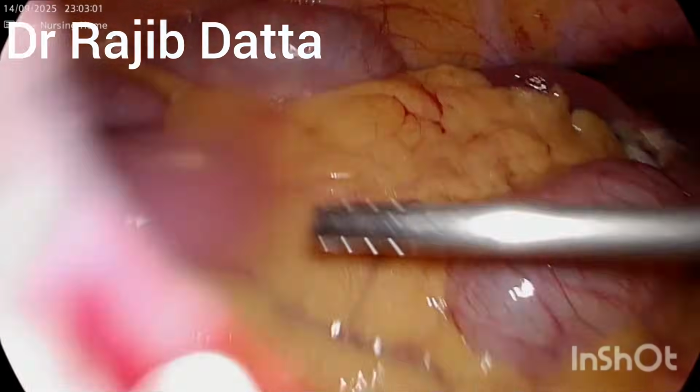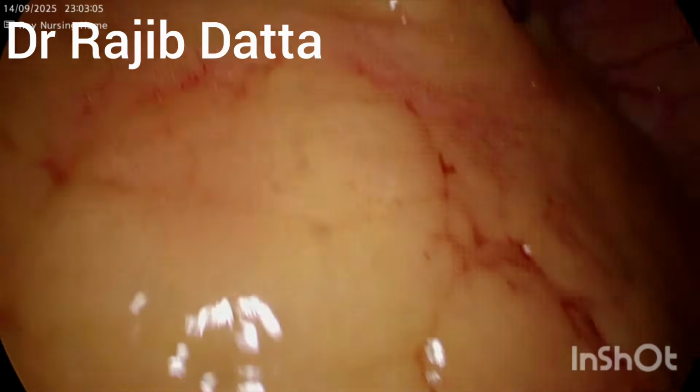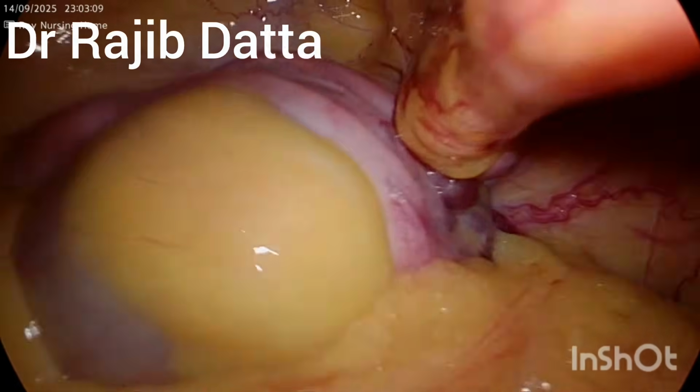So our main purpose, thorough peritoneal toileting, is almost complete.